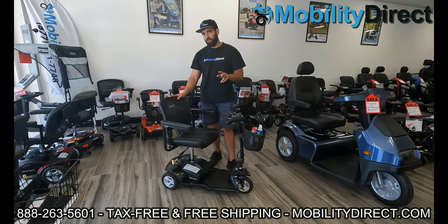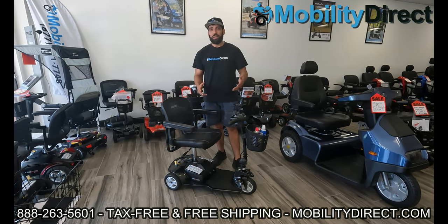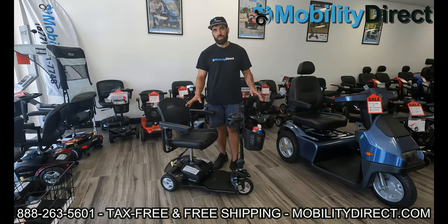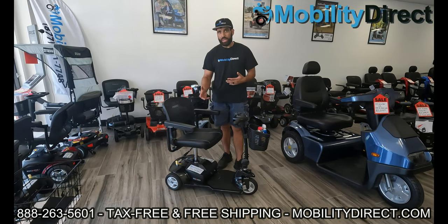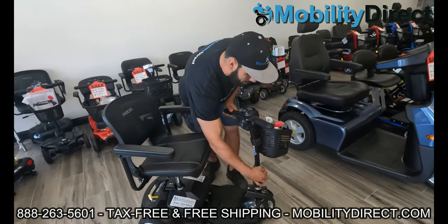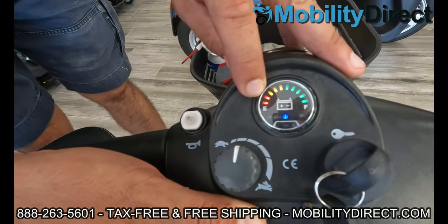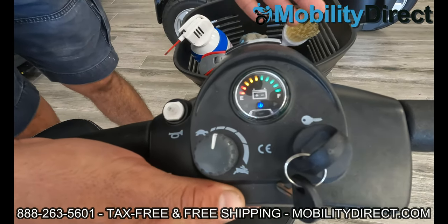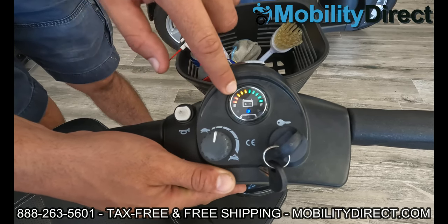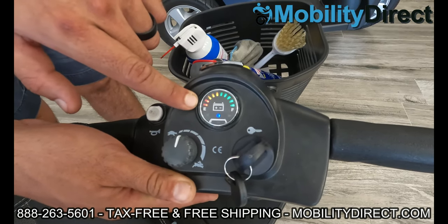Tip number two is keeping your battery charged and maintained properly, which is going to allow you to get the most out of your batteries — because batteries are expensive. Make sure that the battery meter on your scooter doesn't drain down to the red if you can avoid it. Kind of like an automobile, you don't want to run out of gas — fill up at about halfway if you can. If it gets down to the red, you're abusing your batteries. You usually want to start charging when there's only one or two greens left or if you're in the yellow.